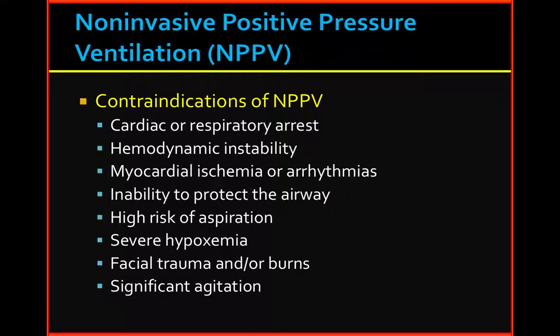If you're going to wean a vent, usually we wean them down to at least 50%. And then we'll put them on some CPAP mode for a little bit, and if they're doing okay with their gas, we'll extubate them. Generally speaking, ventilation is carbon dioxide exchange, and oxygenation is PaO2. There's that classic graph where that steep curve comes off after the pulse ox goes below 90.